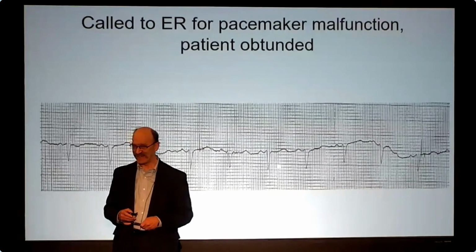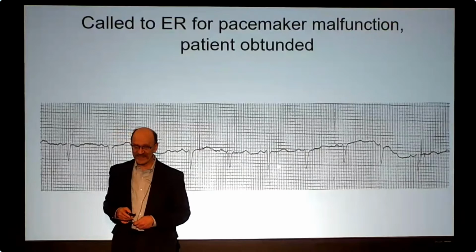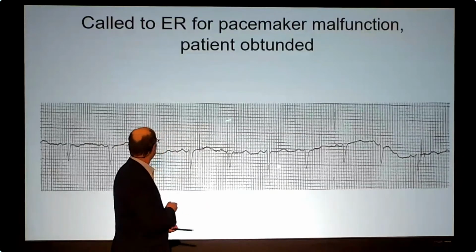He's into ablation. And he would call me and say, Dad, would you talk to this ER doc for me? And I'd talk to the ER doc. I'd say, look, when you're going 100 a minute and the pacemaker lower rate is 60, you're not going to see spikes. I said, check in the morning. It's okay. Check in the morning, you know? So this person is not needing the pacemaker. That's all I can tell you.